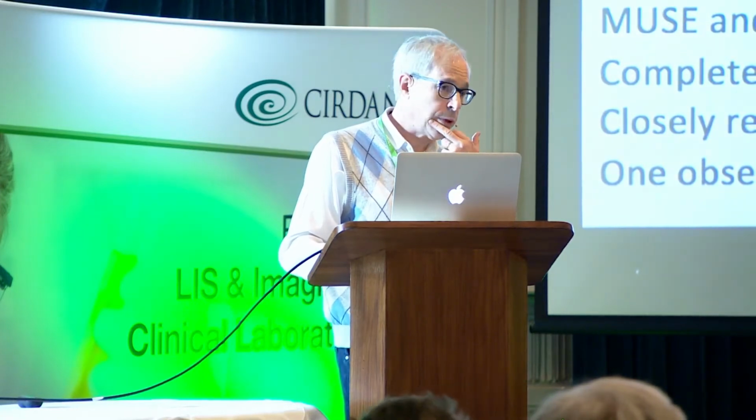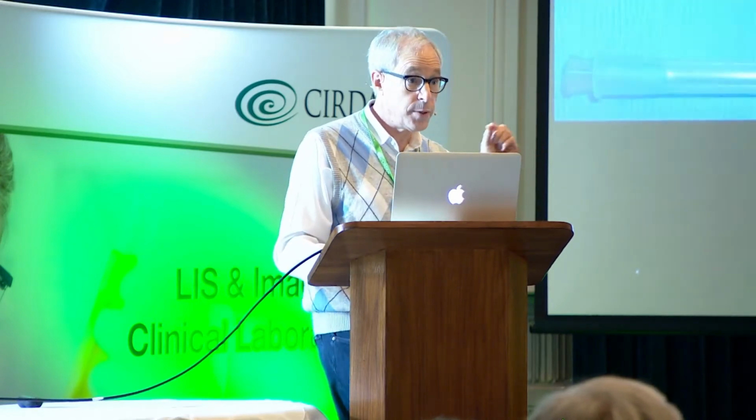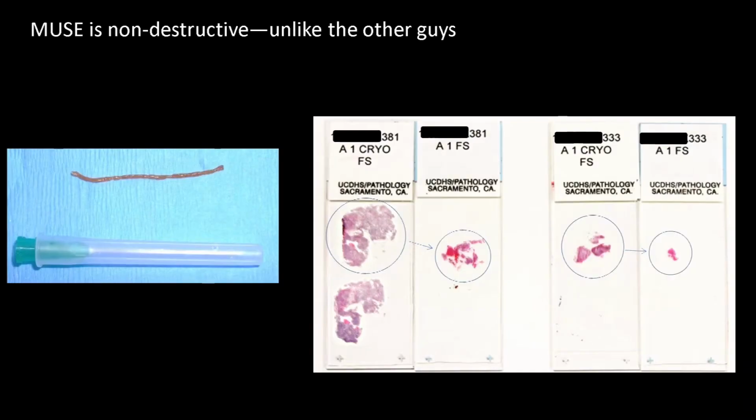You can schedule more visits without waiting for the day or the week, depending on what the logistics are. The other important thing about MUSE is that it's non-destructive. If you're given tiny little needle biopsies, as you've heard already today, every time you make a slide, you lose tissue, and you can see how this tissue goes from this much to this much. And if you then have to scrape that off and get RNA and DNA and do IHC and FISH, you're in a world of hurt.